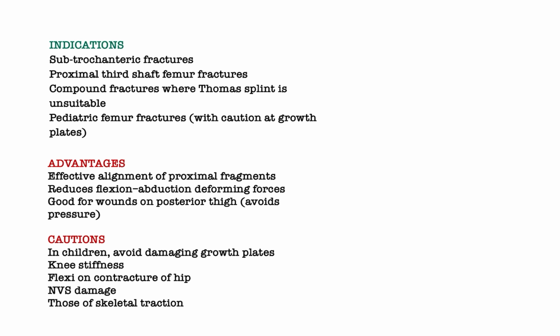Advantage is effective alignment of the proximal and distal fragments. It reduces the proximal fragment, which is in flexion and abduction, with respect to the distal fragment, which is in adduction. It is also advantageous in case there is a wound on the posterior aspect of the thigh. Therefore, without disturbing the traction, one can examine the wound and do dressing if required.